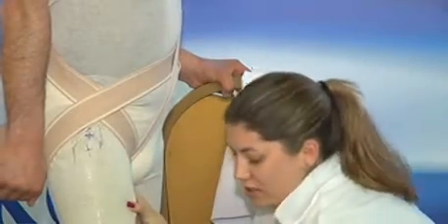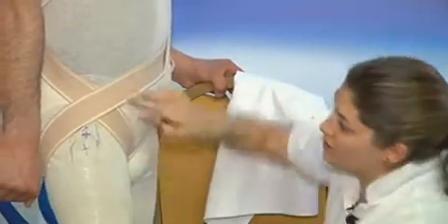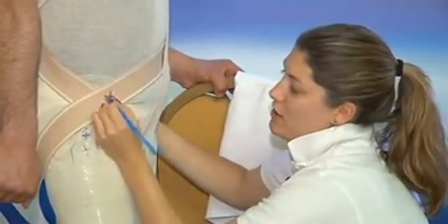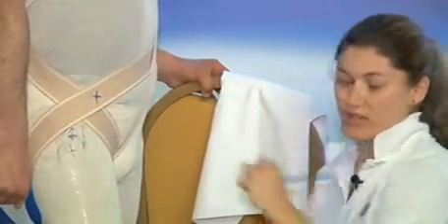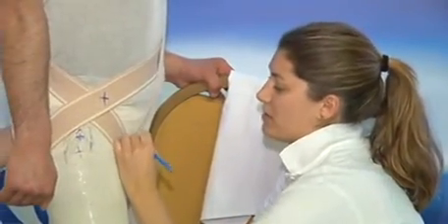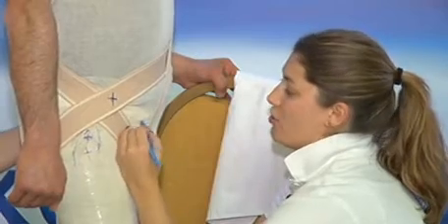We will have our adductor tendon marked there, and as you can see, I've just covered my anterior superior iliac spine, so I'm just marking there. Okay, so now I can make some trim lines so that they will come out in my cast. I'll make them slightly bigger than I would in my final socket, but at least I know where to cover.